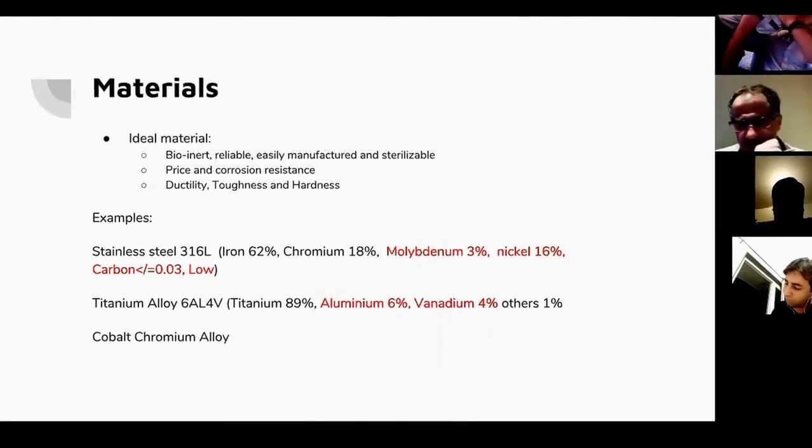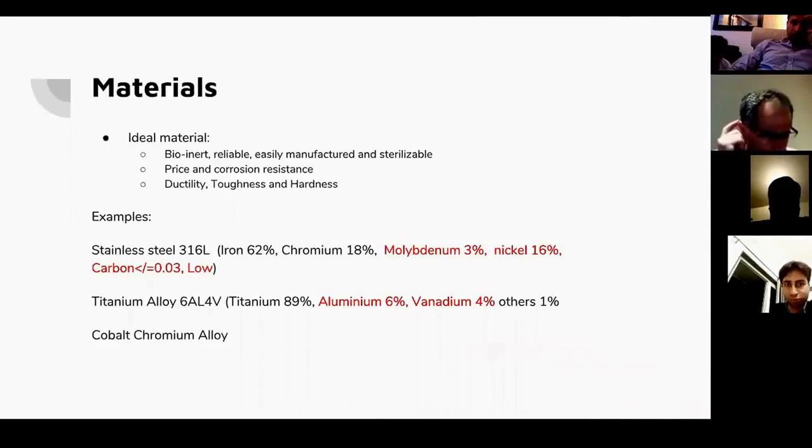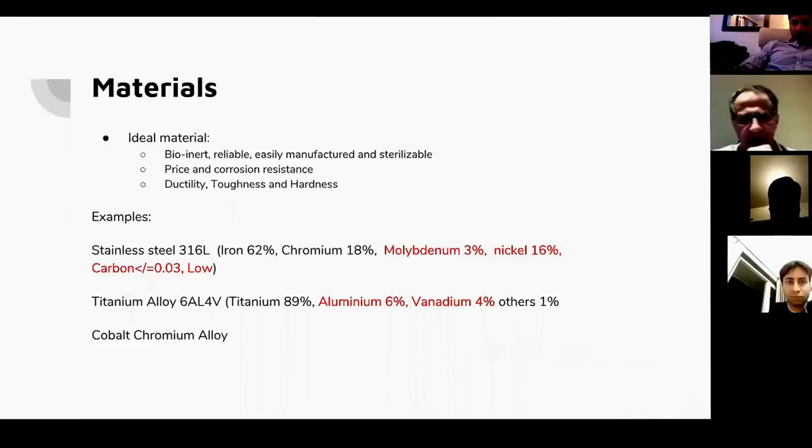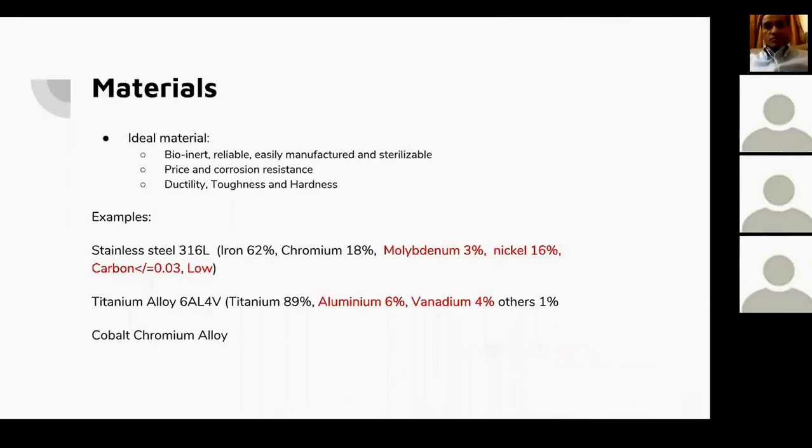The next question they usually ask is, what is titanium alloy, which we use, the 6Al-4V, aluminium 6%, vanadium 4%. Know that vanadium does have some potential ion reaction problems, and that's potentially a question that can be asked, especially if you have scratches on your titanium plate or titanium rod. But the nice thing about titanium is it's self-passivating. Okay, so that's quite a useful feature of it.